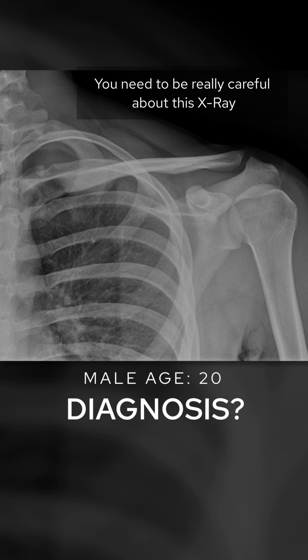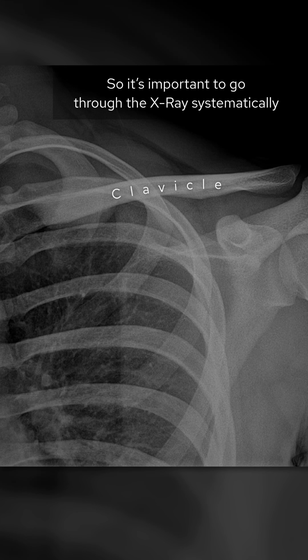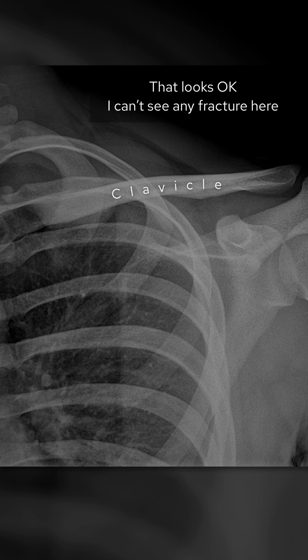You need to be really careful about this x-ray. Let's go through the case systematically. First, let's have a look at the clavicle — that looks okay, I can't see any fracture here.